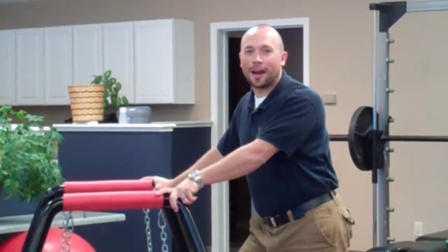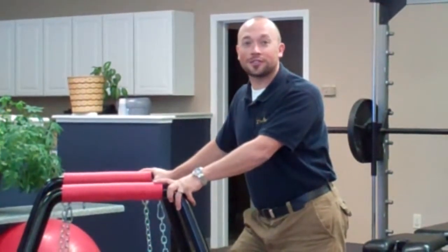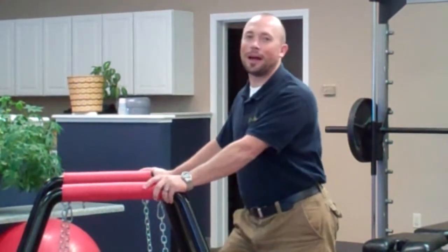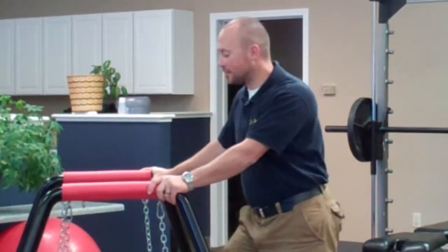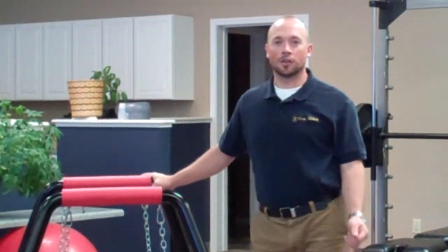Welcome back to our radio blog on the shuttle balance. First off, I want to thank Todd and the rest of the shuttle systems for the nice upgrade — we now have the shuttle balance pro. We really appreciate it. Thank you guys. Today we're going to step back and do a more basic exercise again. We're going to do the lunge.